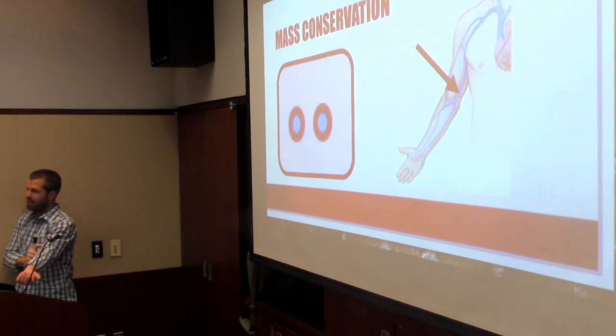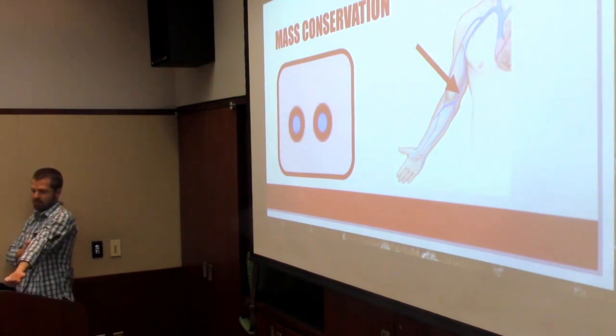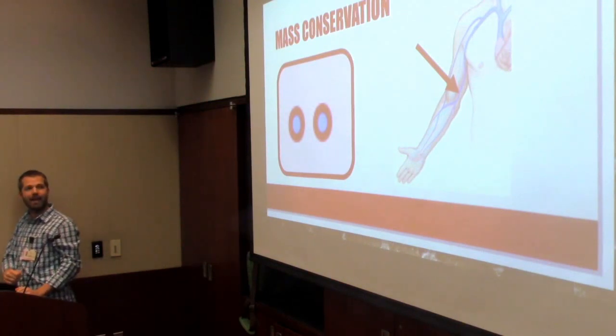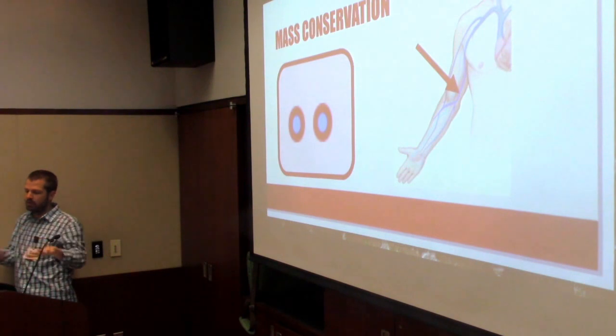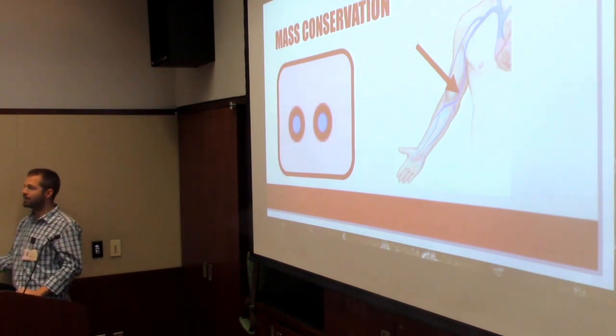So most people, I can get right here, and if you're gonna screw up, just keep moving up the chain. Maybe the intern tried here and stabbed into oblivion a month ago. Move a little bit higher up. And once people have been stabbed into oblivion where all their good vessels are gone, there's a vessel somewhere in their body that has gotten larger.